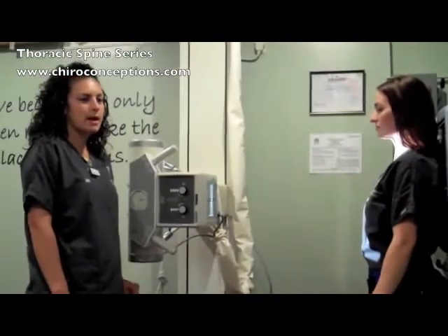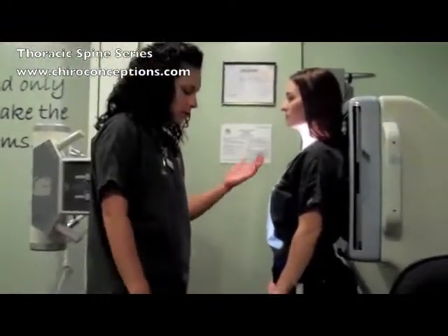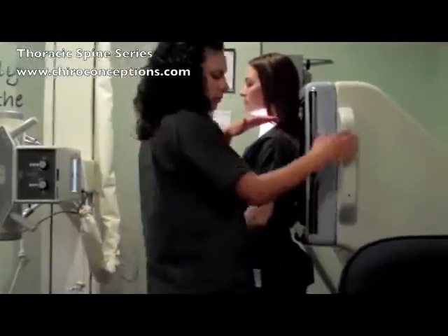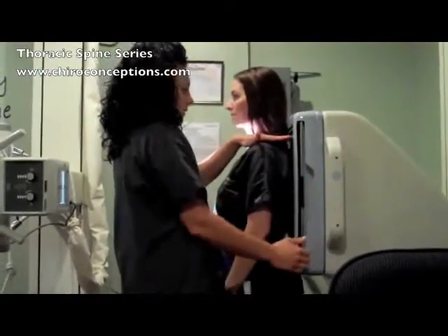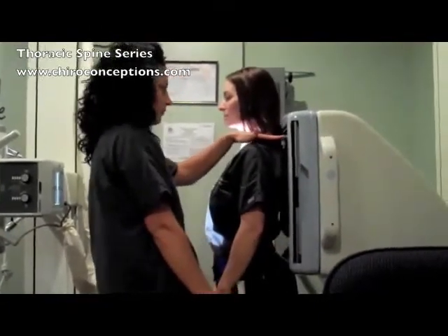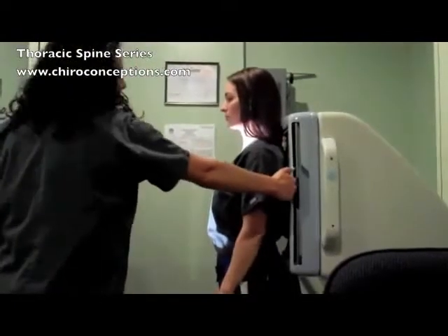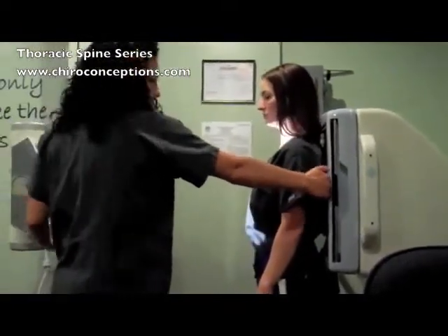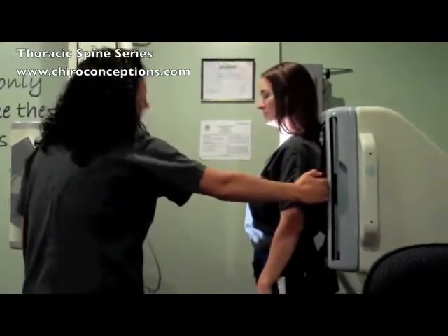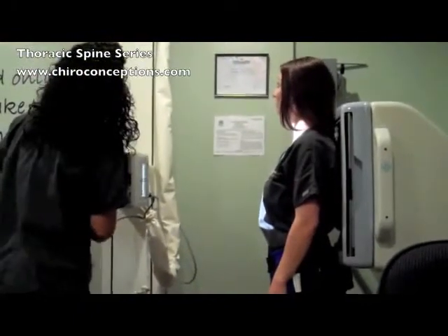Now we're going to go over our thoracic spine, so we'll do AP first. What you want to do is properly shield the patient, line your bucky up, and make sure you get to the top of the shoulders. I measure touching the top of her shoulder to make sure it doesn't run off the grid. Then you want to measure and line your bucky up to your grid. Your centering point should be at T7, and your SID should be at 40.